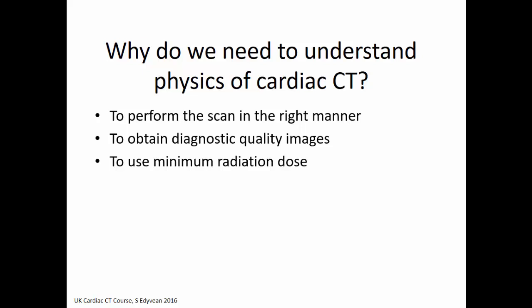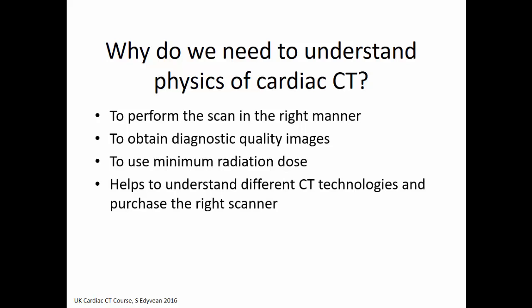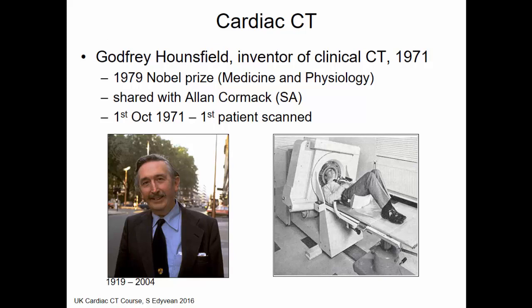Cardiac CT has a huge potential for giving large radiation doses, and that was an area of concern many years ago. But the techniques today do allow us to scan at very significantly lower doses. And also, by understanding the different CT technologies, it helps you when you're purchasing a new scanner. And there are some good references that I've put at the end of this talk.